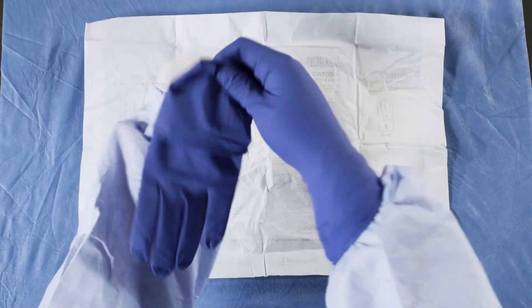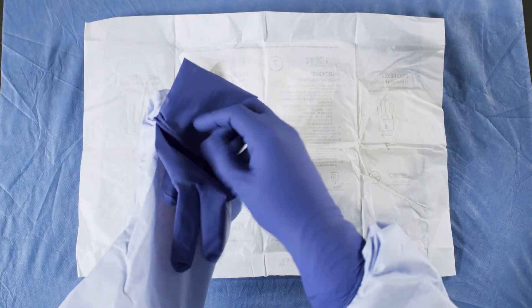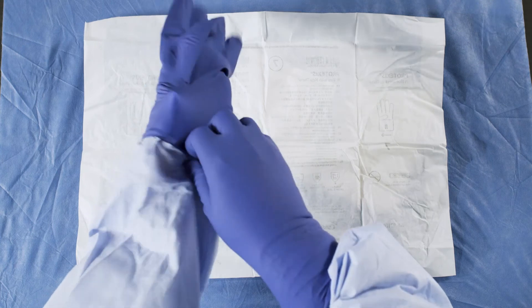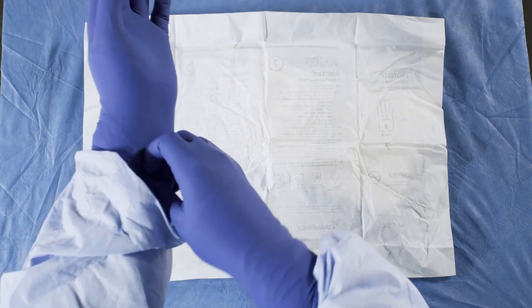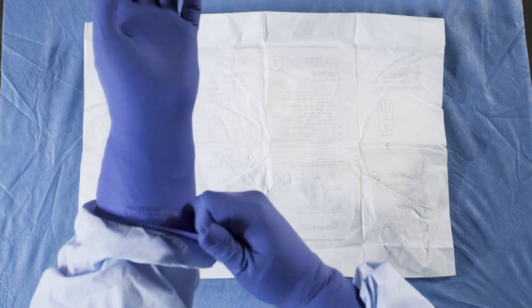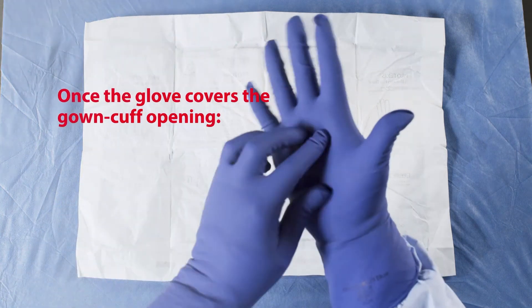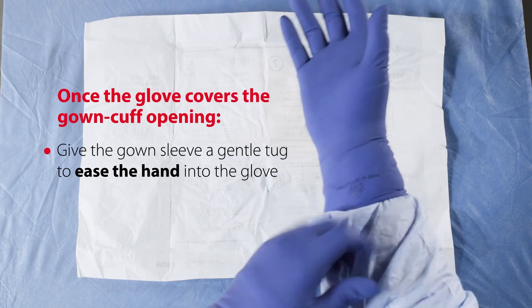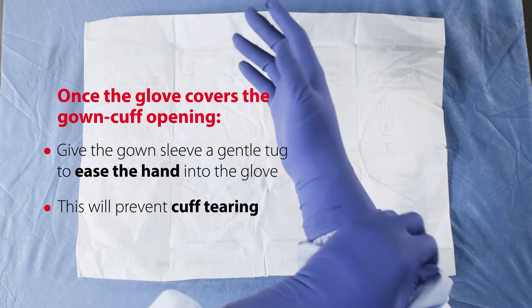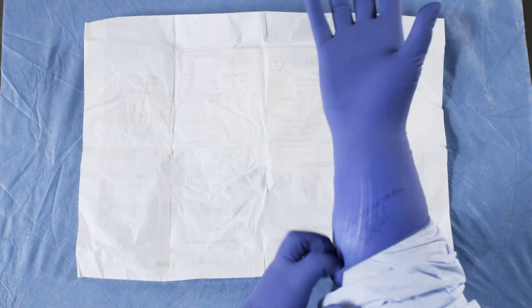Pick up the non-dominant hand glove with your glove-covered, dominant hand. Repeat this process to glove your non-dominant hand. Pull on the dominant and non-dominant hand top gloves. Once the glove covers the gown cuff opening, give the gown sleeve a gentle tug to ease the hand into the glove. This will prevent cuff tearing.